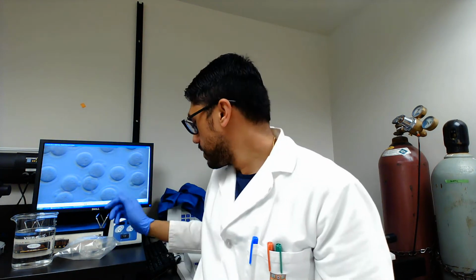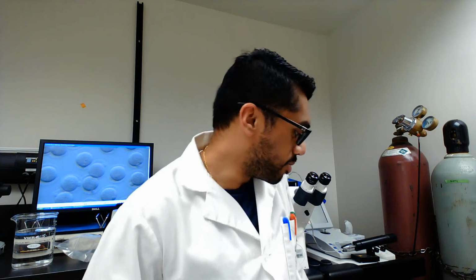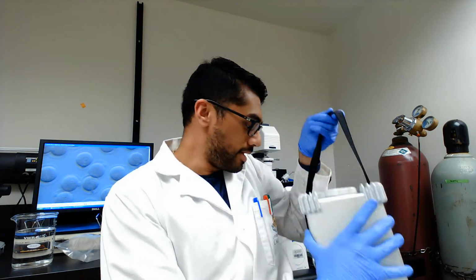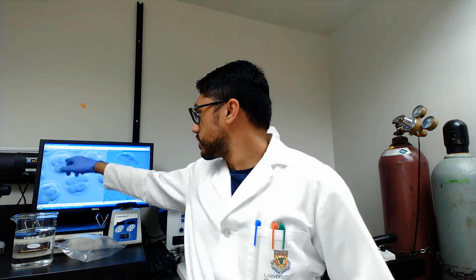Now, after in vitro culture, which can take up to 6 days in humans, we can culture these zygotes into blastocysts in things like plastic bags, which is what I do. You can actually see the dish inside there. Or you can use something like a portable incubator, something like this, in addition to a regular tissue culture incubator. After about a couple days, you'll see cell divisions called cleavage. Within reproduction, we call it cleavage, which is cell division without an increase in size. You can see a 4-cell embryo here, and it's relatively the same size as that single-celled zygote that we talked about earlier.